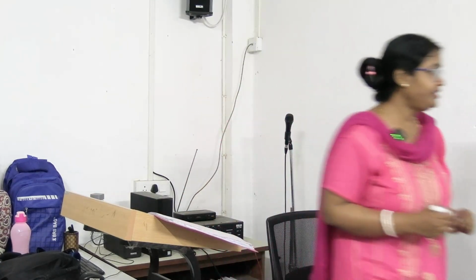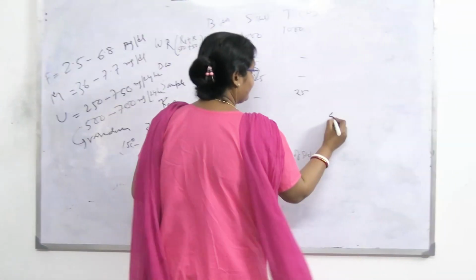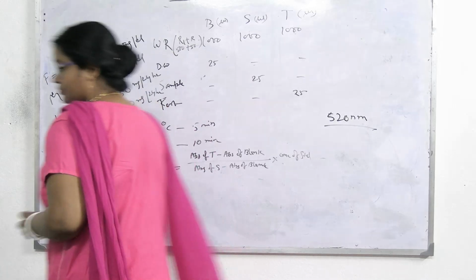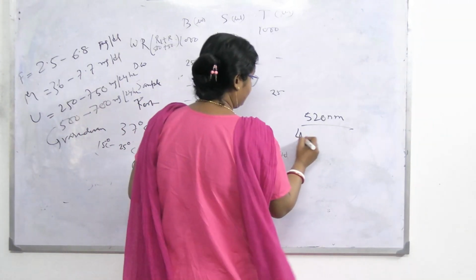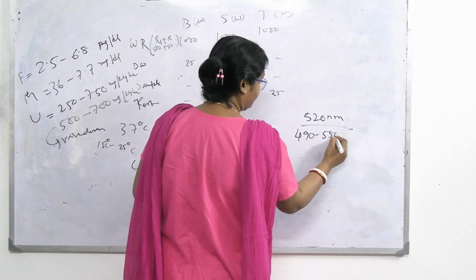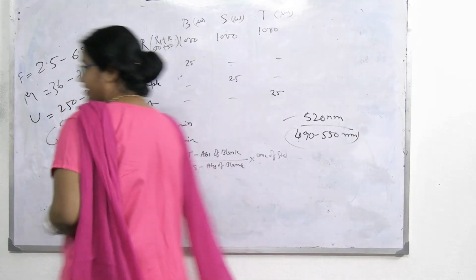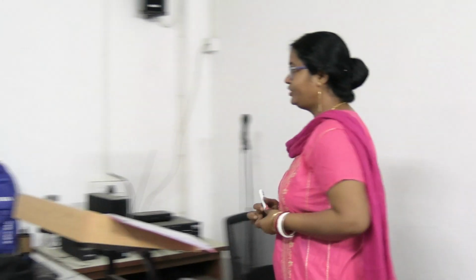And you will measure at 520 nanometer. This filter is also fine, 520 or 490 to 550 nanometer.